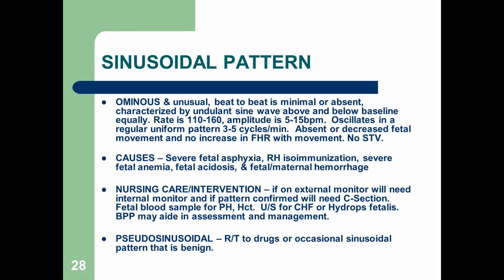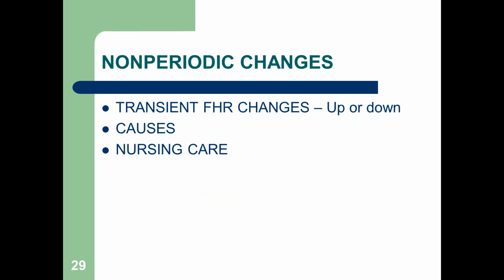Again, when you have some ominous patterns where you don't have a lot of fluctuations, if you will, within your heart rate, you may have a baby in trouble, okay?